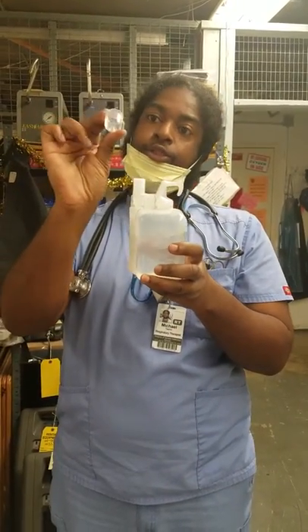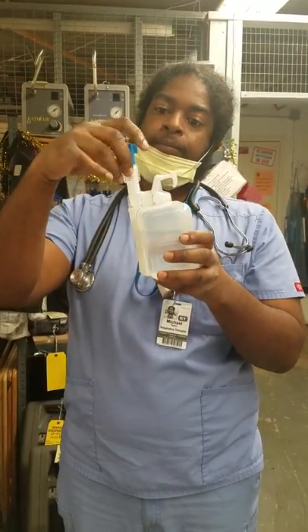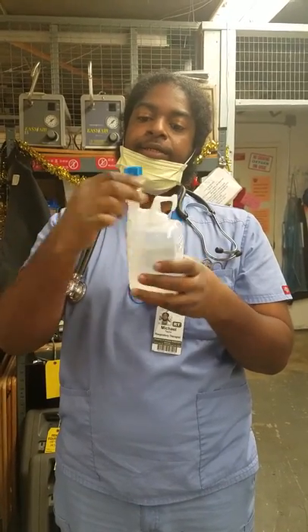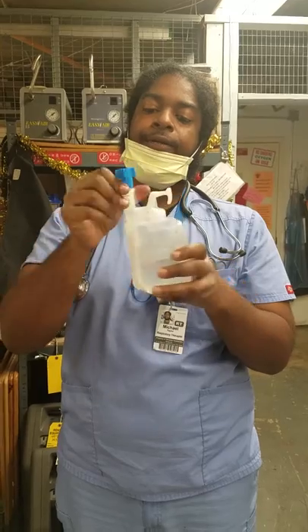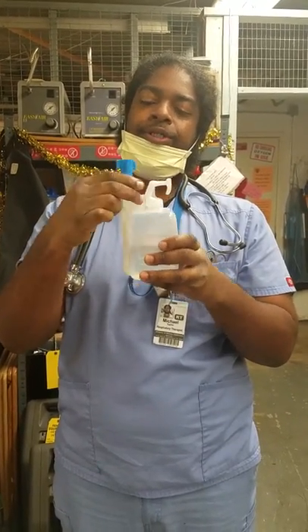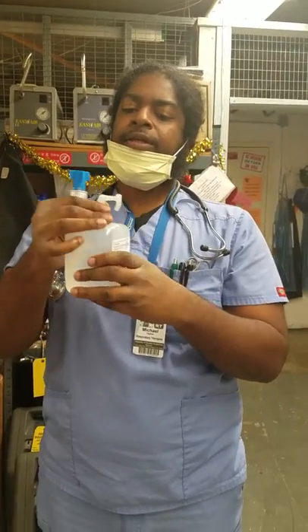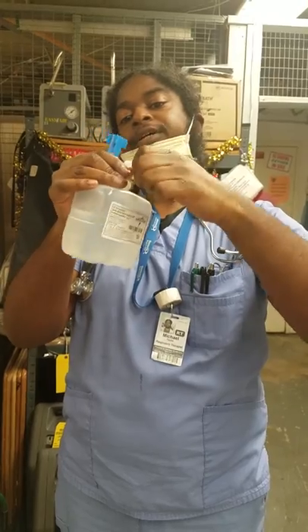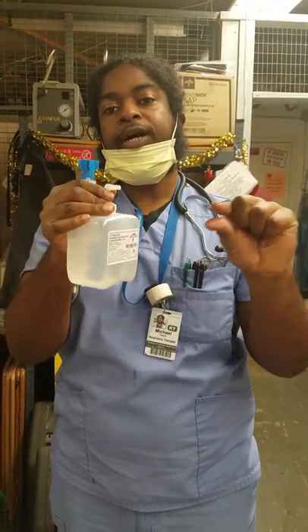This is going to tap in — there's a little sharp piece underneath. It's going to tap in through the plastic, so try to put it on straight and keep twisting until you cannot twist anymore. Make sure it's nice and snug. There's a little plastic piece here — you twist it and it pops off. This is where your oxygen tubing is going to get connected in line.